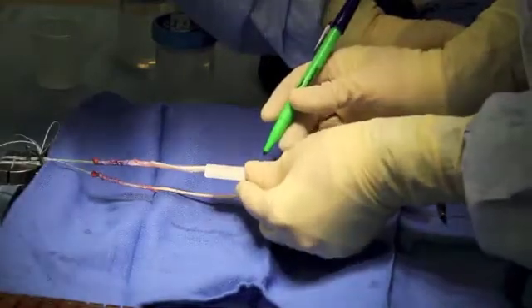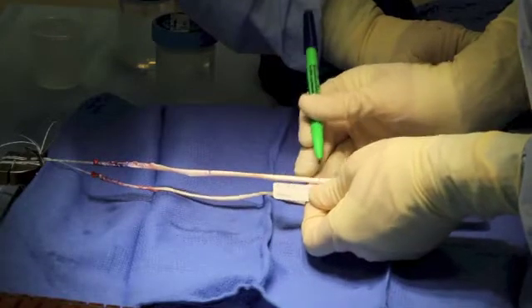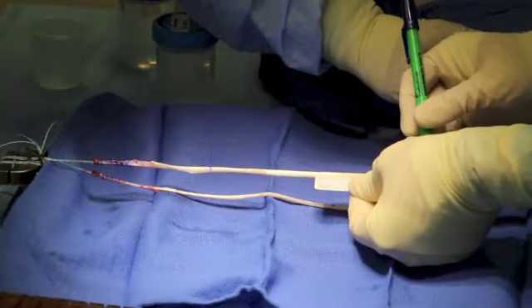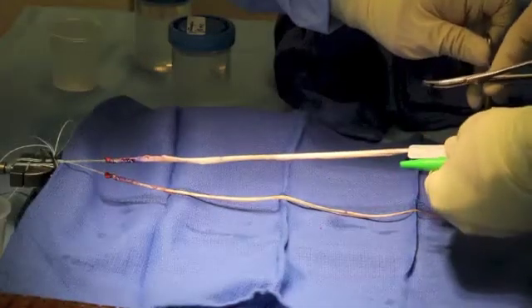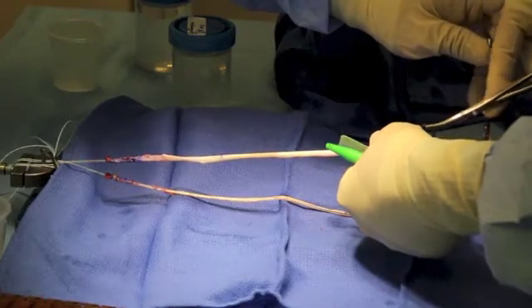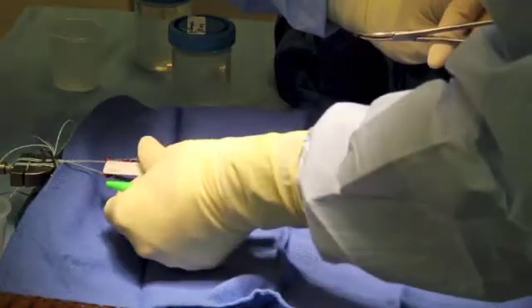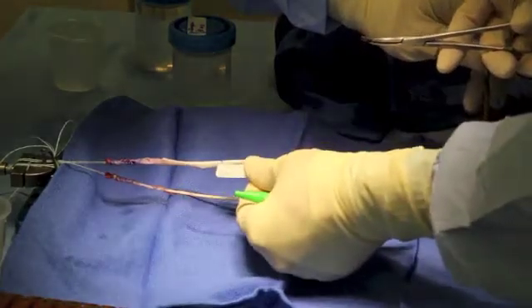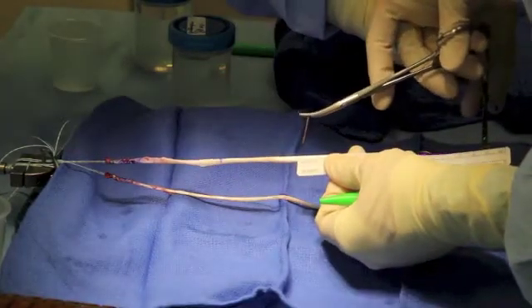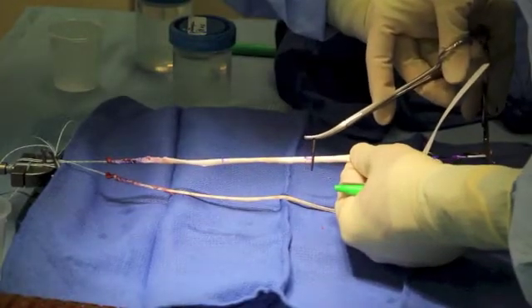The overall length of the graft has been measured, and it has been determined that the semitendinosus is long enough for tripling into three strands with a final construct length of 9 cm. Care is taken to precisely measure and mark these intervals as they will affect individual strand tensioning. The areas of whip stitching are being marked out: 2 cm upstream and 1.5 cm downstream from the third most distal fold, and 2 cm upstream from the second mid-substance fold. Again, care is taken to precisely measure these areas.